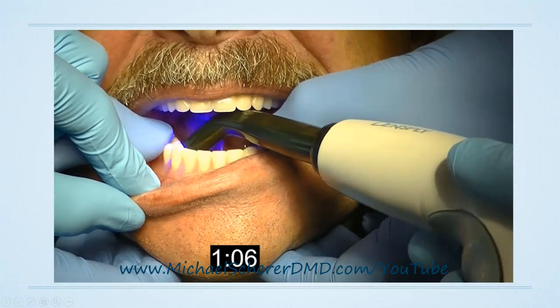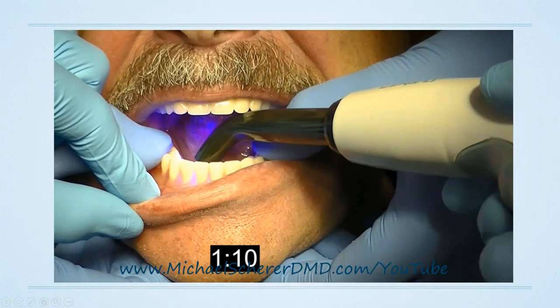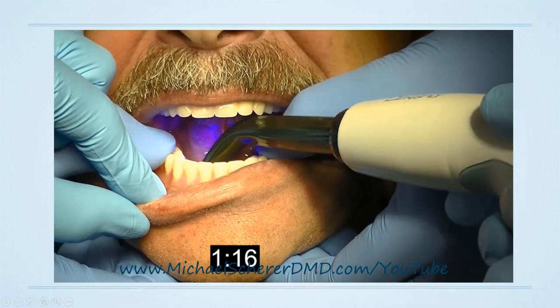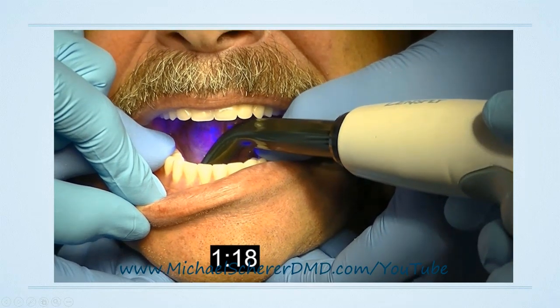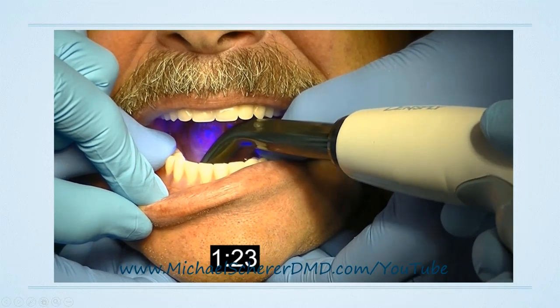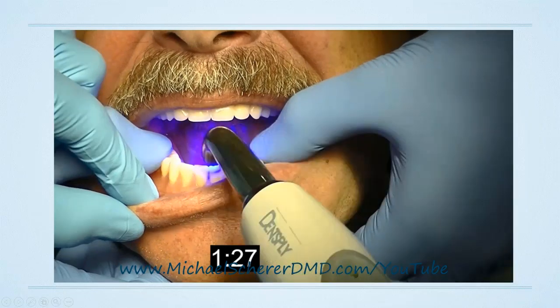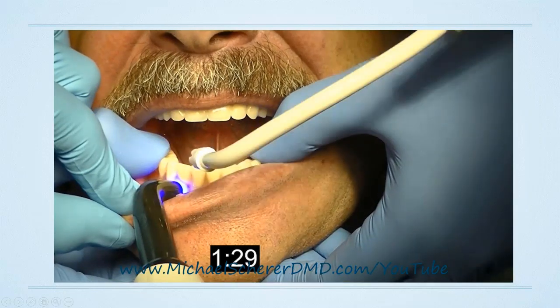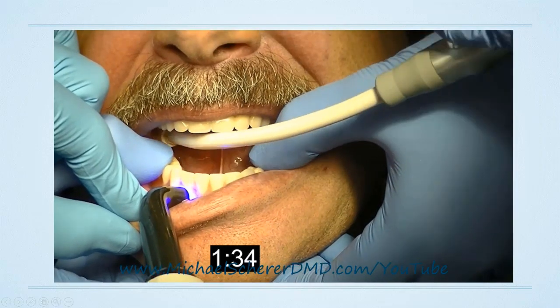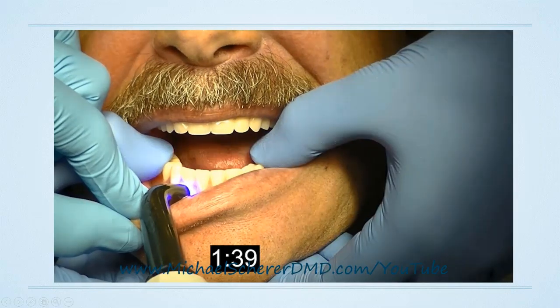Many of you will say, well, I'm a little bit scared because then I think the bite's going to be off. I can tell you, I can't even tell you how many times I've done this, approximately 9 to 9.5 times out of 10, I very rarely have to adjust the occlusion. And if I do have to adjust the occlusion after doing this procedure, just holding the denture into place, chances are my bite was wrong in the first place with the denture. Interesting. So if I can ensure that I've got the denture properly seated on top of the soft tissue ridge, it ensures that I have a fully soft tissue supported overdenture.